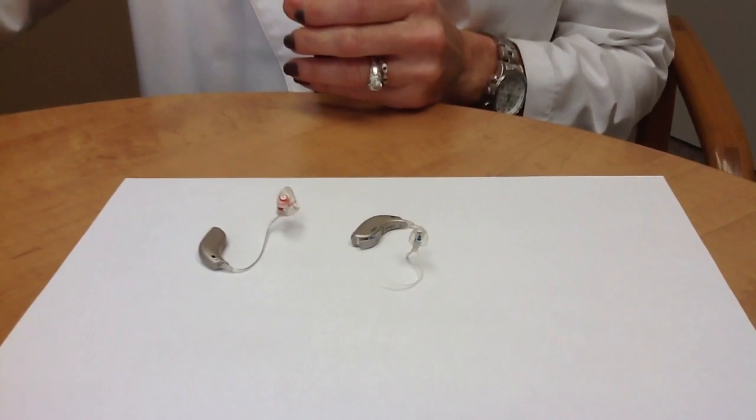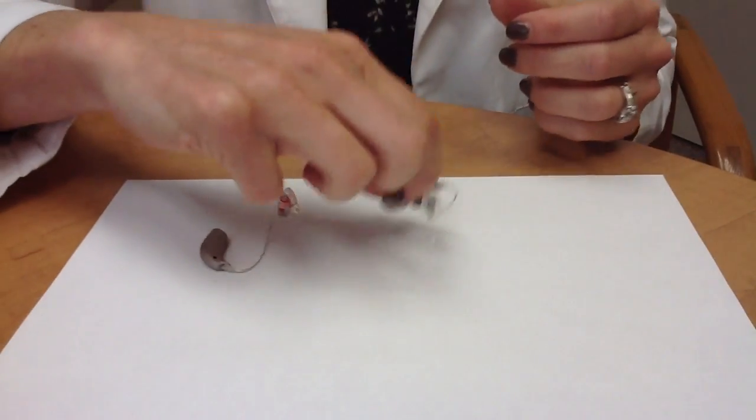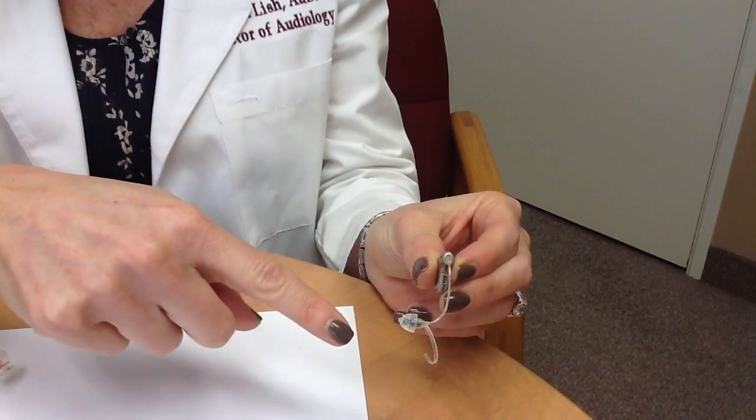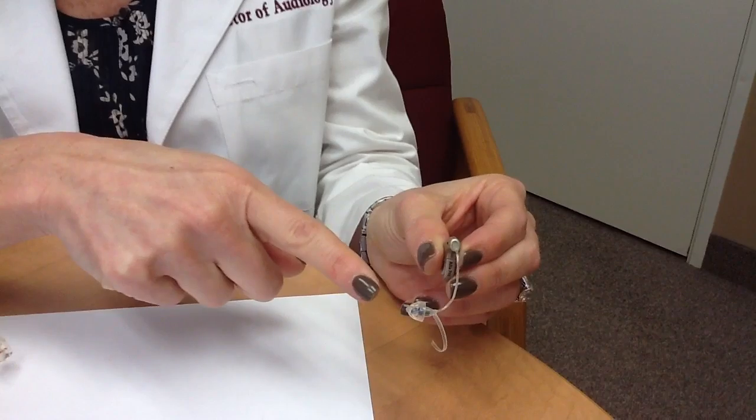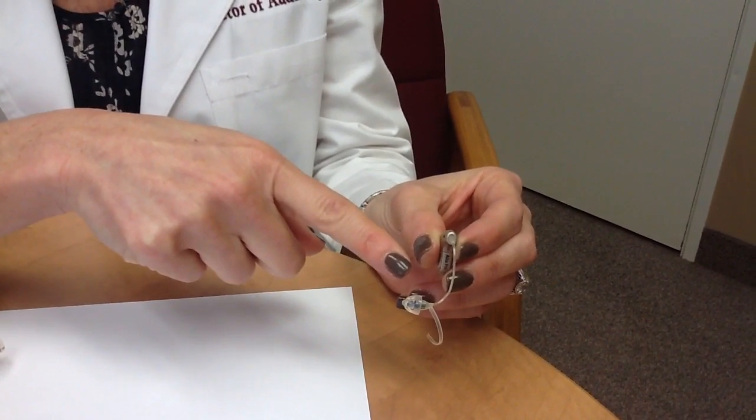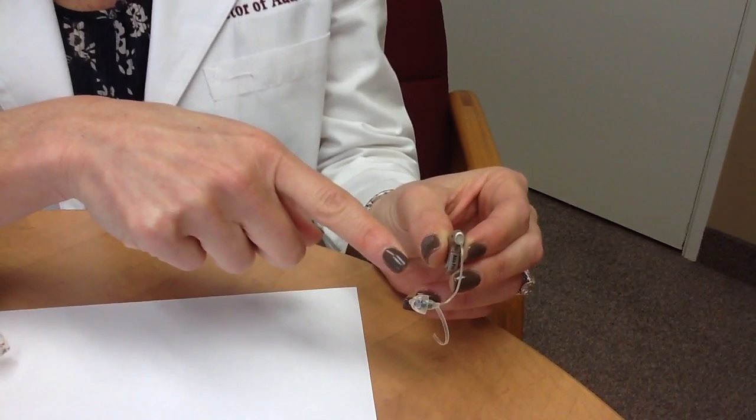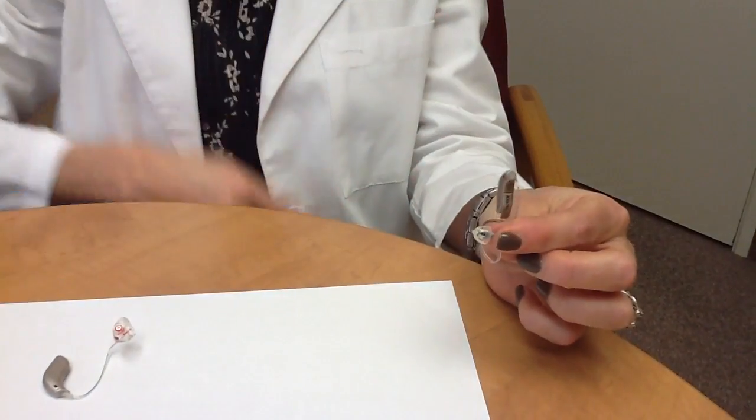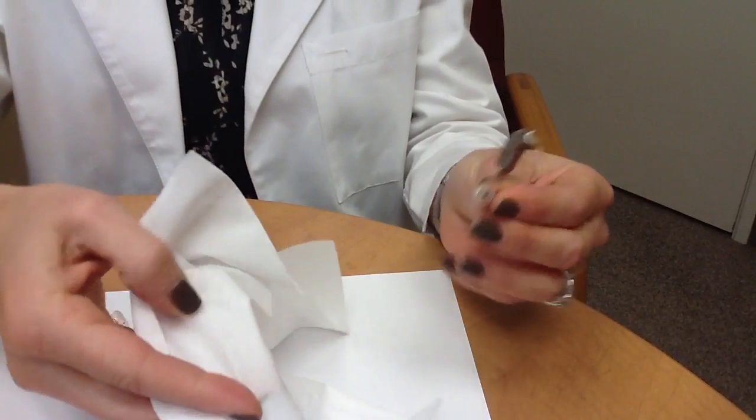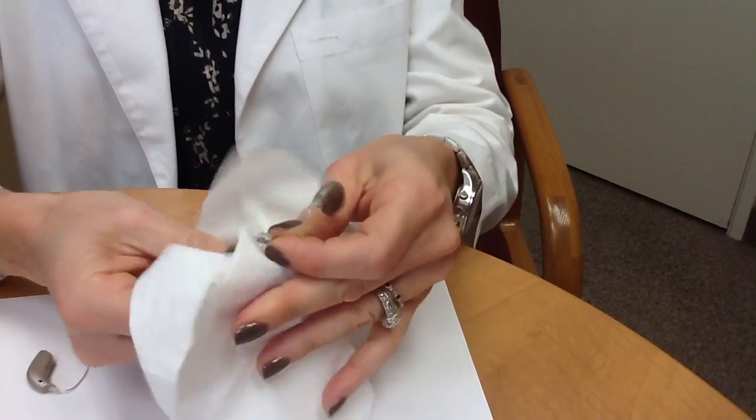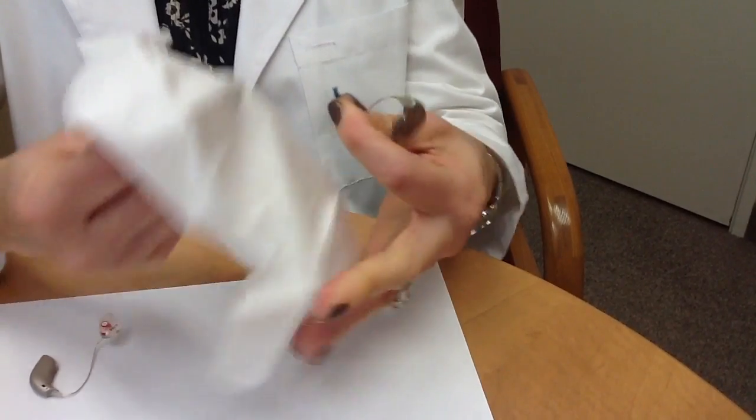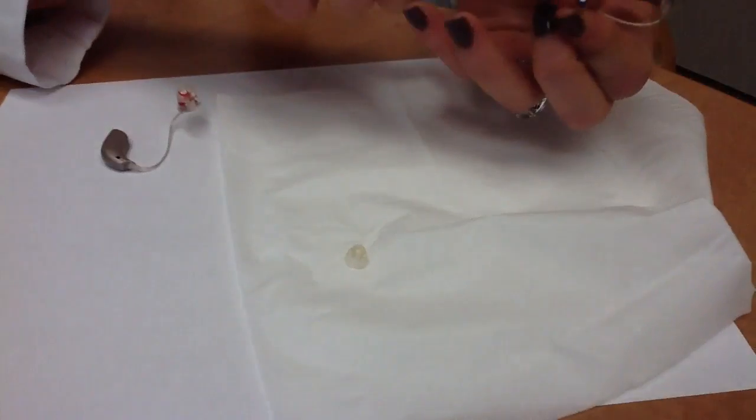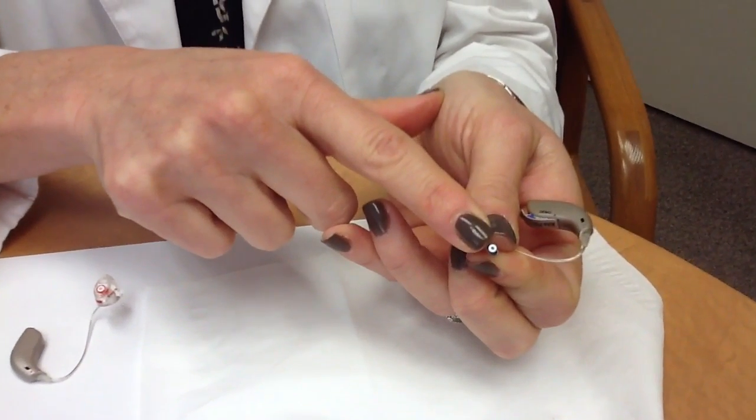Now I'm going to show you how to change it on a receiver-in-the-canal style hearing aid that has a dome on the end. The wax guard is actually located underneath the dome, so the first thing you have to do is remove the dome. I think the easiest way to do that is to grab the end of the dome in a tissue. If you pinch the end and wiggle it off, the dome comes off very easily and exposes another white wax guard.